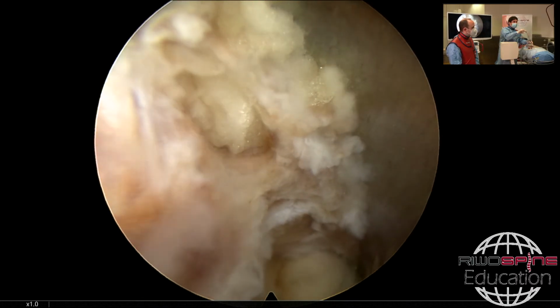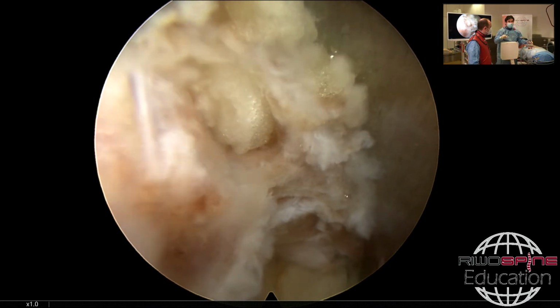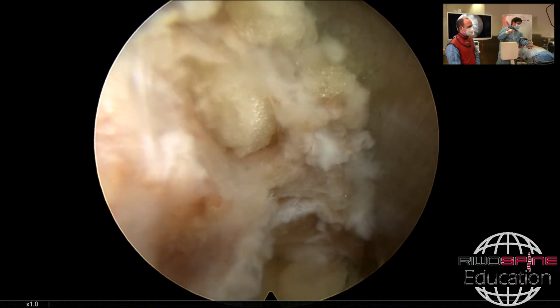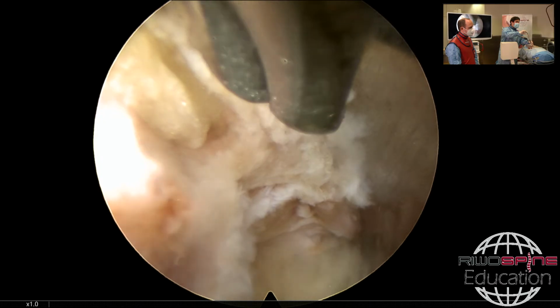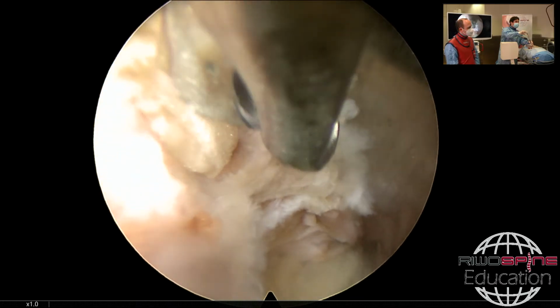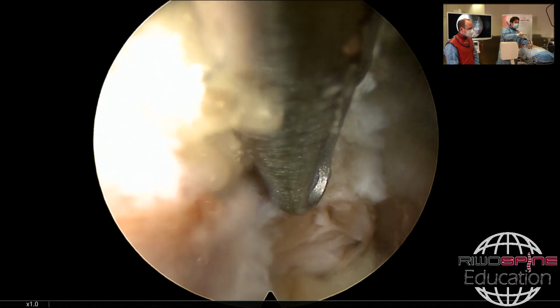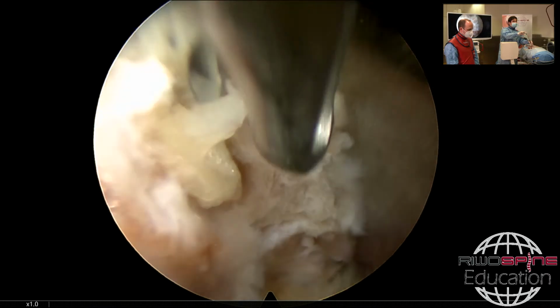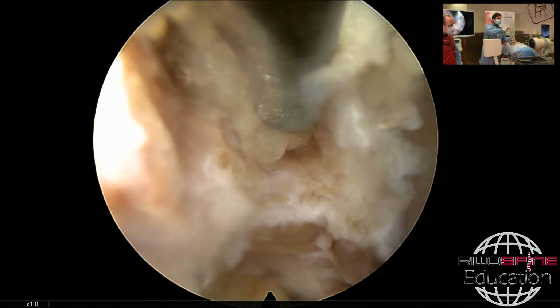I can understand that surgeons feel it's dangerous, that they could catch the dura, but the design of this scissor is really important on this step. As you see, the cutting part is just behind the back part, and with the tip of the scissor, first you push, and the cutting part comes later. Then you cut it, and once you open it, the irrigation creates a space there.